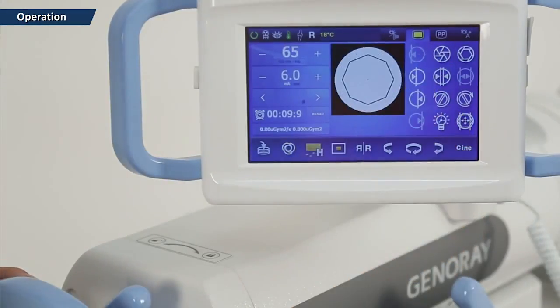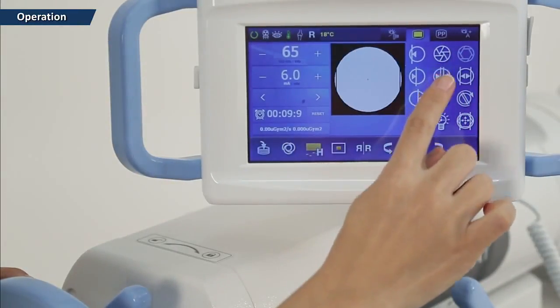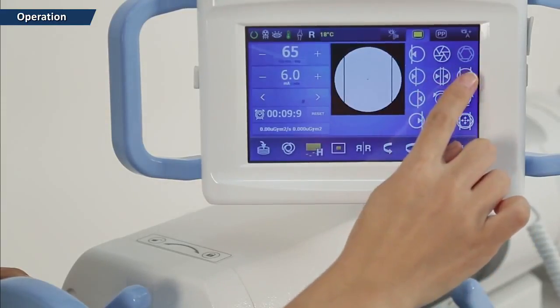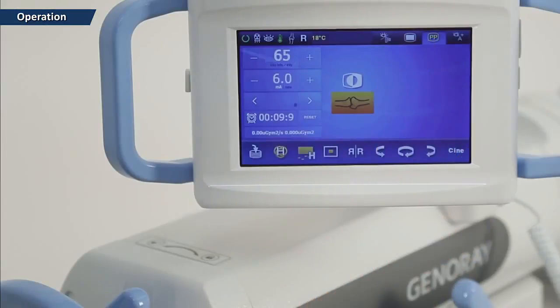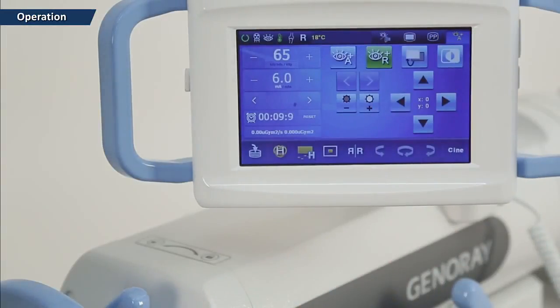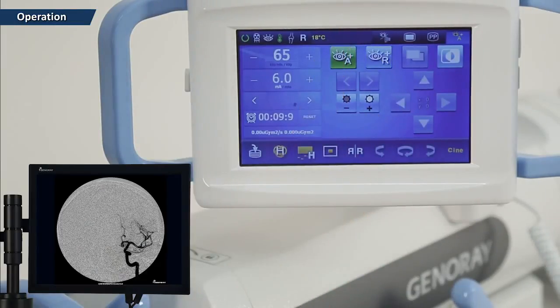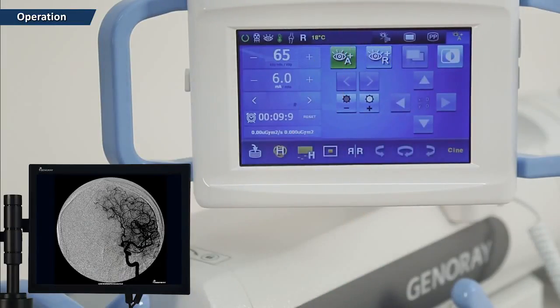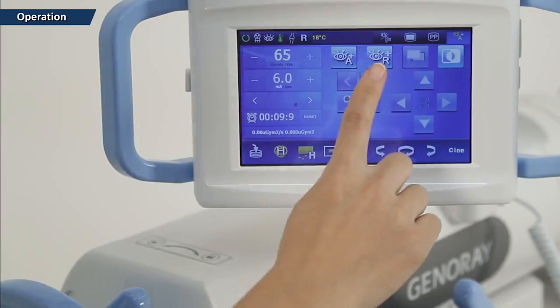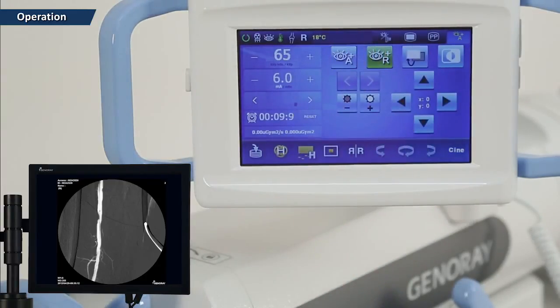On the collimator tab, iris adjustment, shutter adjustment, and shutter rotation adjustment can be carried out. The PP (post-processing) tab is used to invert the colour of the image. The DSA tab includes the angiography function, which is used to see the shape of blood vessels, and the roadmap function, which allows you to see whether it has reached the targeted place after filming blood vessels. Inverting the colour of an image is also possible.